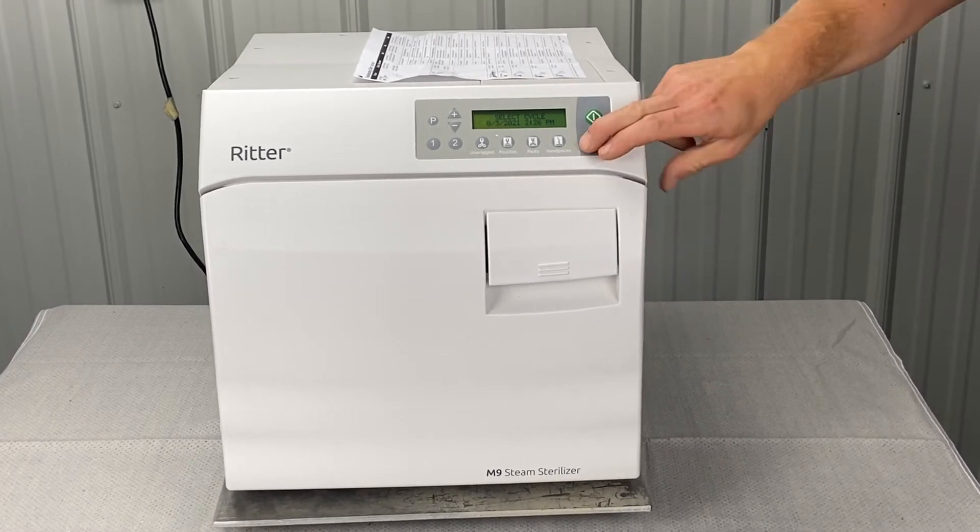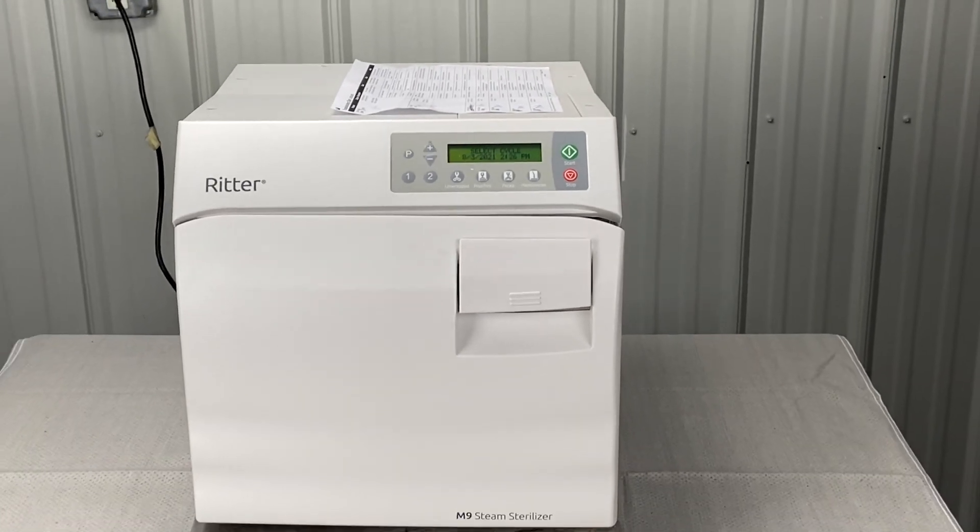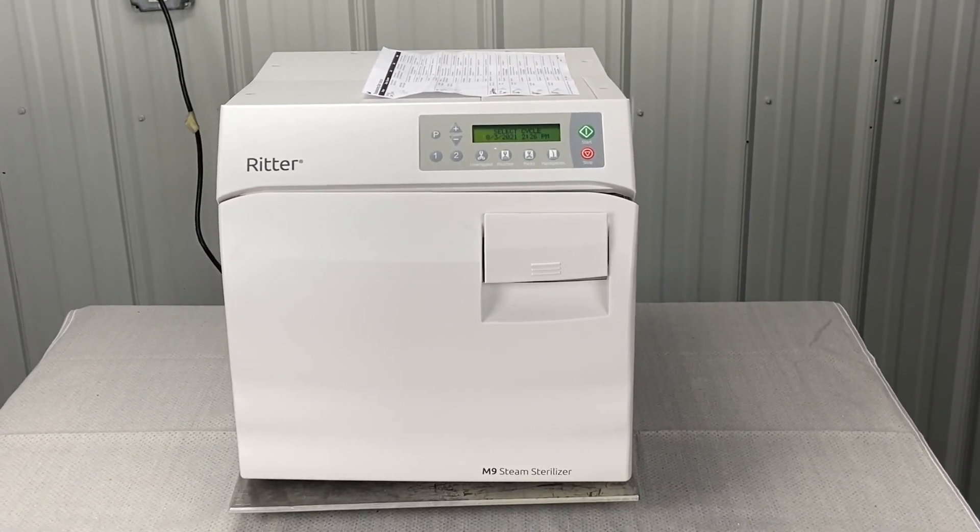Check out the door — hit the stop button, or open the door and hit the stop button. If the problem persists and it's a brand new unit, you might have to contact your dealer.